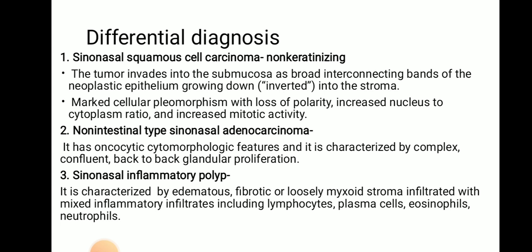Sinonasal inflammatory polyp is characterized by edematous, fibrotic or loosely arranged myxoid stroma infiltrated with mixed inflammatory infiltrates including lymphocytes, plasma cells, eosinophils and neutrophils.